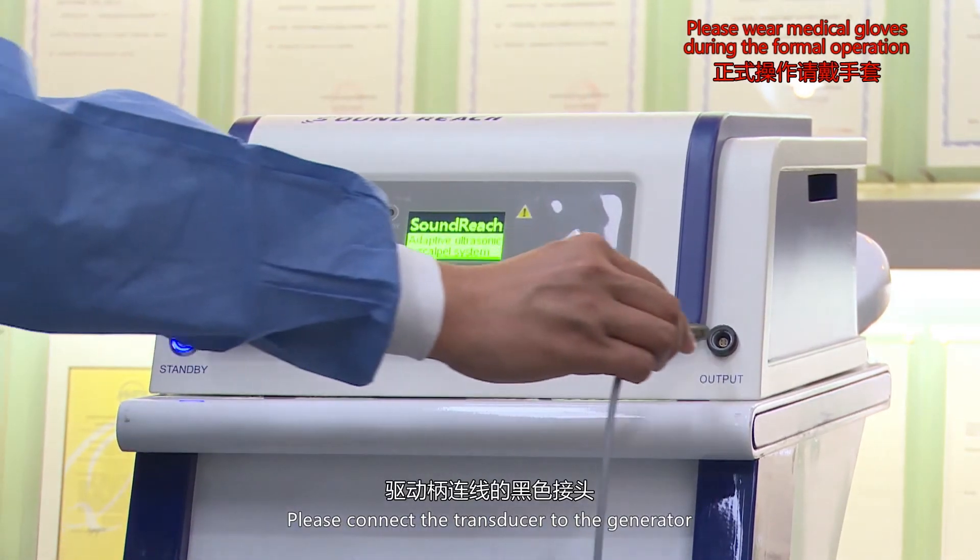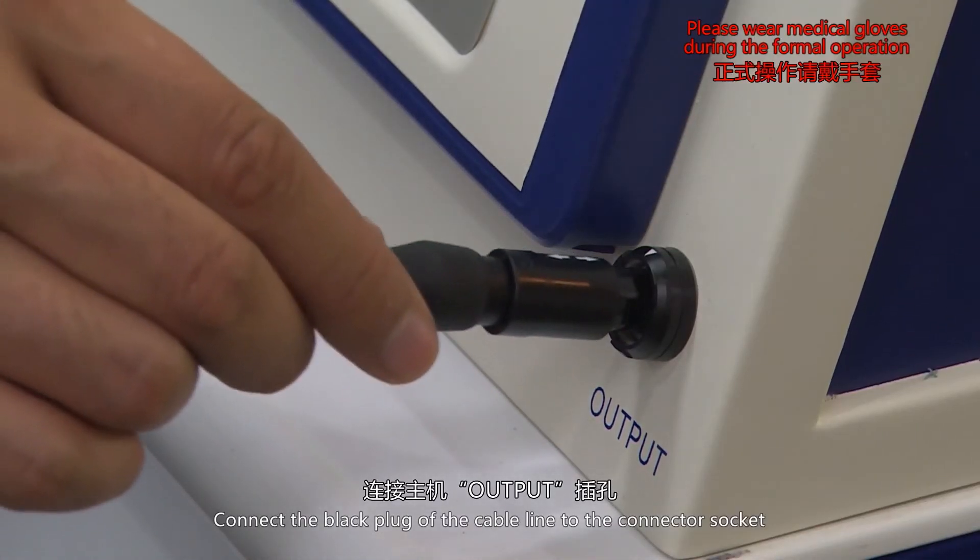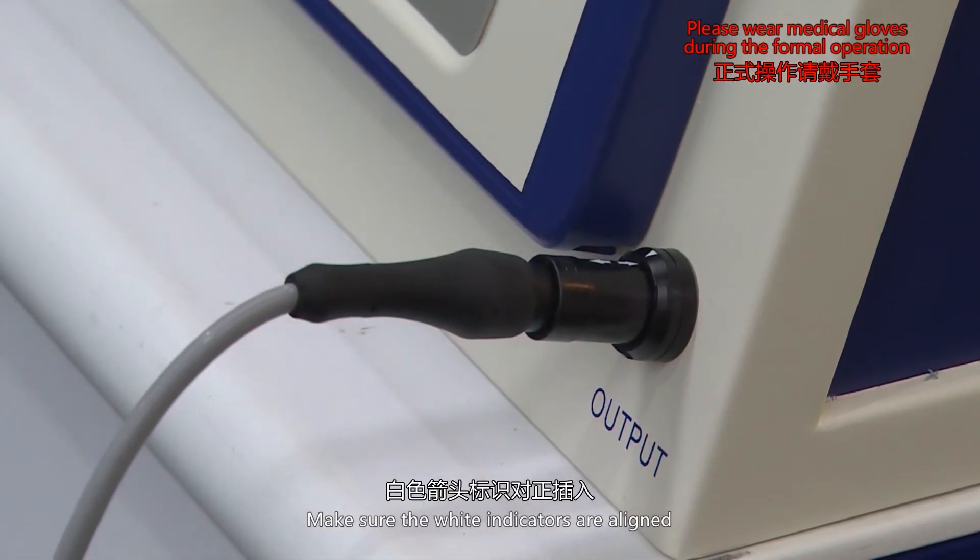Please connect the transducer to the generator. Connect the black plug of the cable line to the connector socket. Make sure the white indicators are aligned.